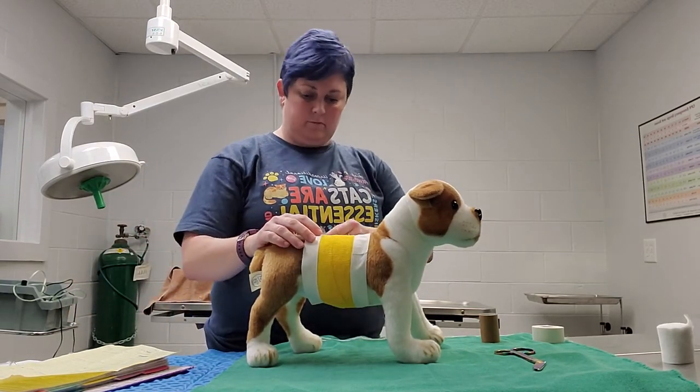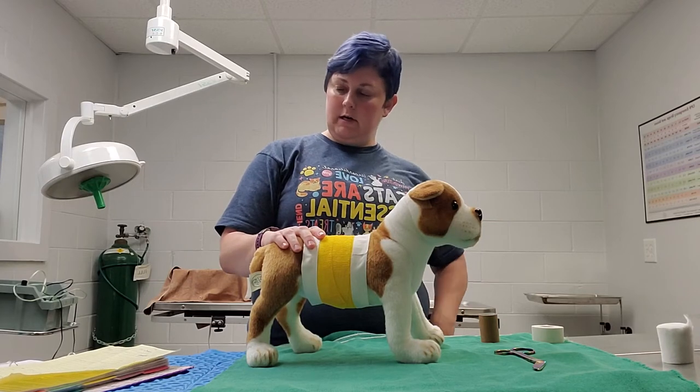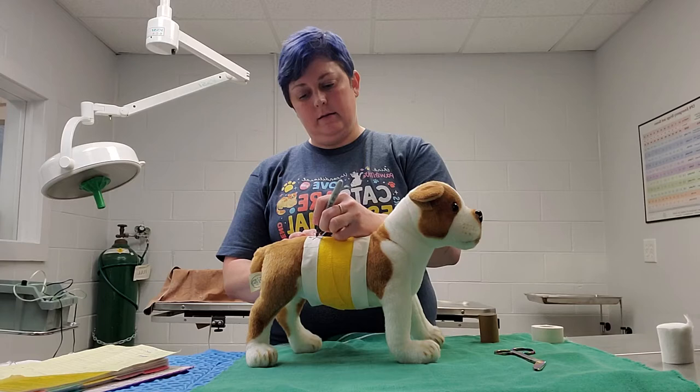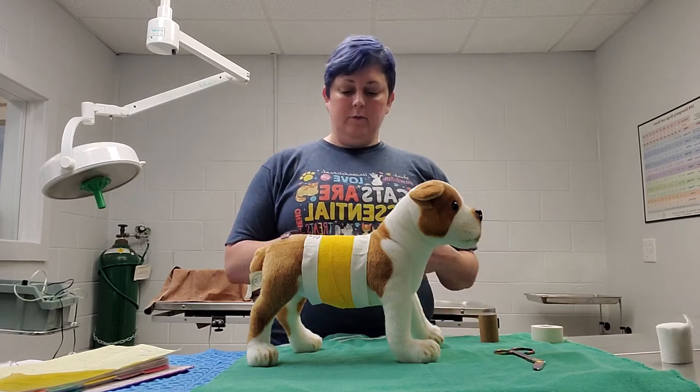We could date it — today is the 13th — and then initial it, so that way you know when it was put on.